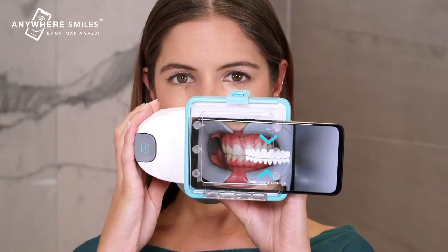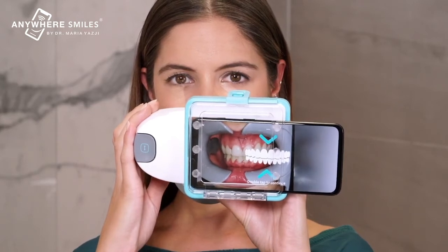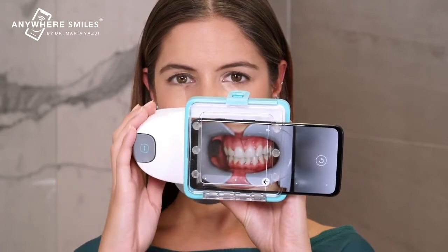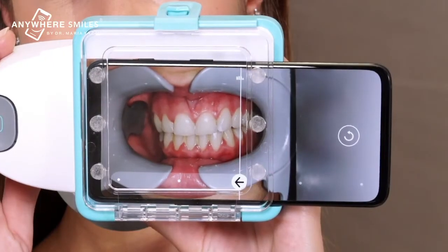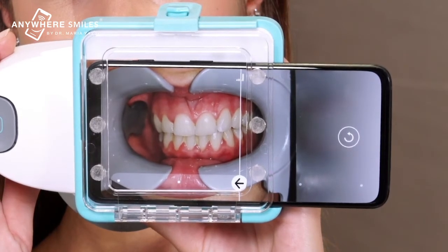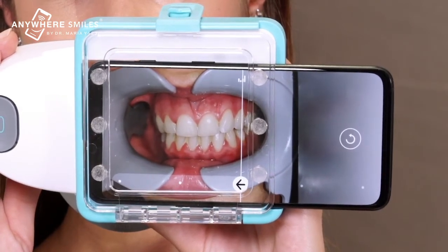During the scan, audio instructions will guide you through the steps. Let's go. Double tap on the screen to start the scan. For this step, bite down on your back teeth and keep your teeth together. Start moving your head as soon as you hear the camera make a sound.